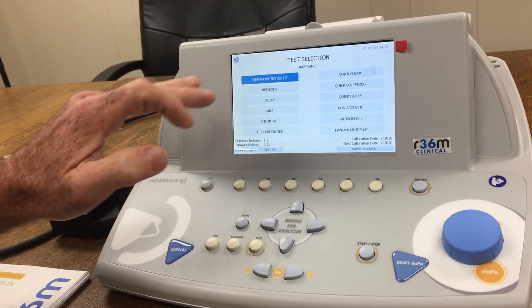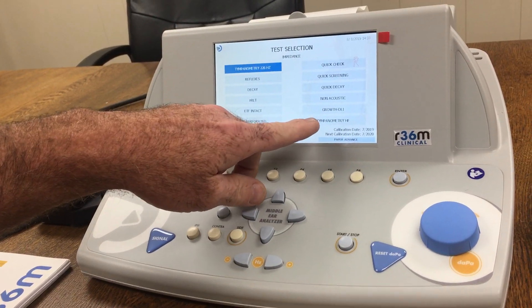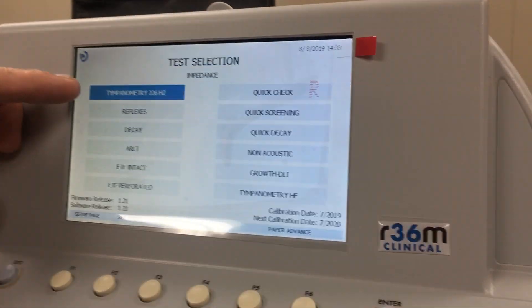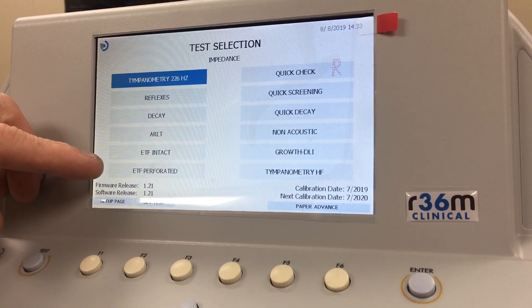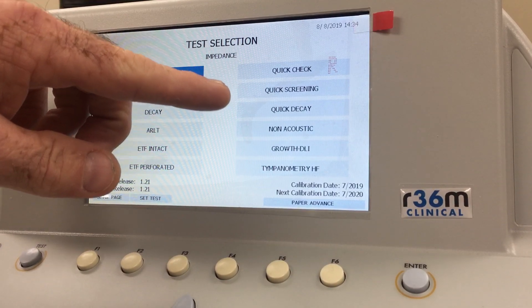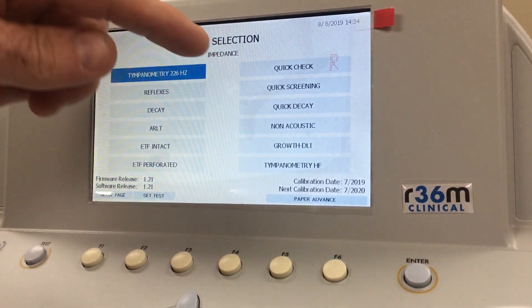Because this is a multi-frequency clinical unit, you have tympanometry high frequency, regular tympanometry at 226 Hz, reflex, decay, ARLT, ETF intact, ETF perforation, quick check, quick screening, quick decay, non-acoustic, and growth DLI.